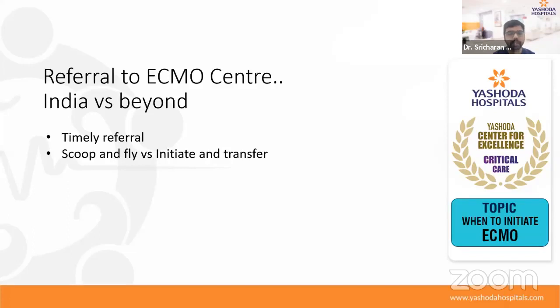In the entirety of the CESAR trial, there is only one center in the UK which is considered an ECMO center, and all the patients who were randomized to receive ECMO should be shifted to that center. And if we look deeper, they did not go to the center of concern and initiate ECMO there and shift the patient. In fact, what they did was the patient was shifted to the ECMO center after randomization, and the patient was kept in the original center unless he was stable enough for transfer.